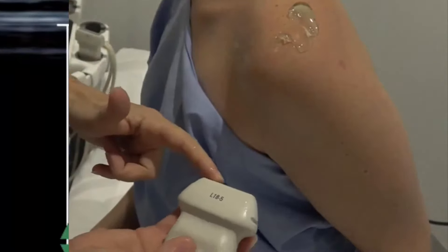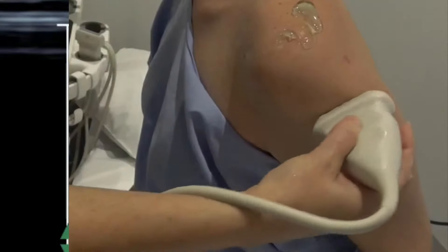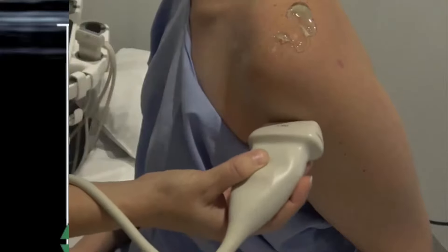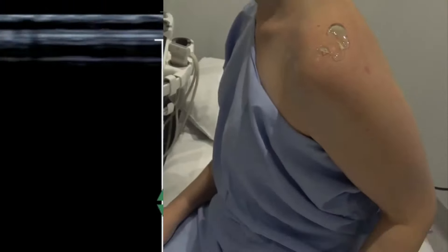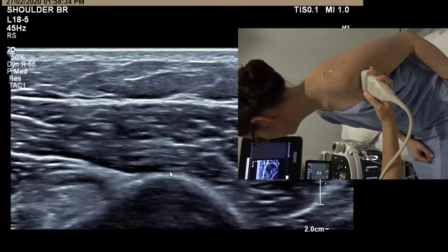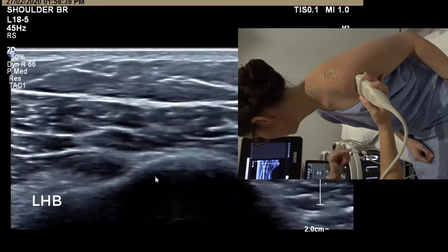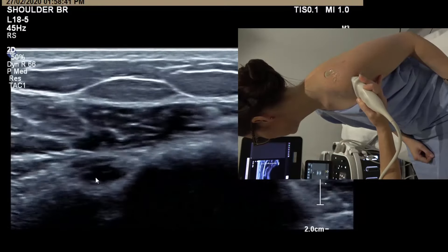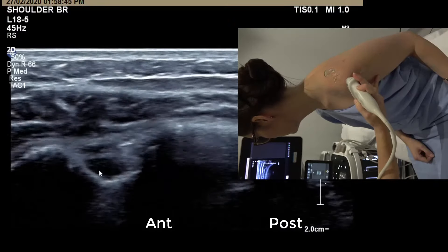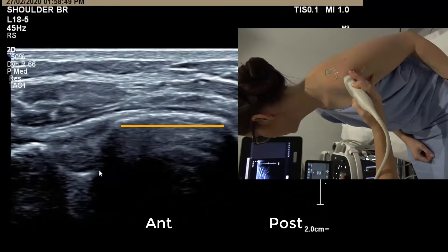Plonk the front of the probe right on that groove. Imagine where a sleeve would sit — the bottom of a cap sleeve is the angle our camera is on. We've got the humeral shaft and just the deltoid. Run up with the anterior edge of the camera on the biceps, and you can see the bicipital groove starting to emerge. When we get to the top, the humeral head has a nice angular appearance.